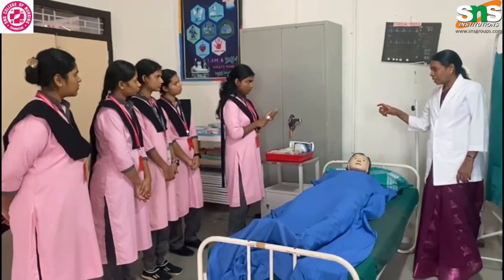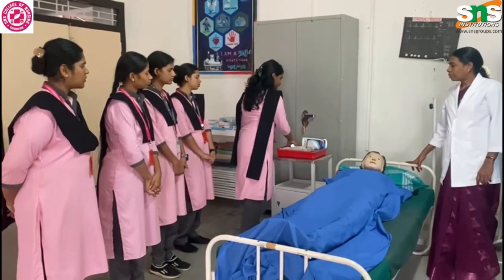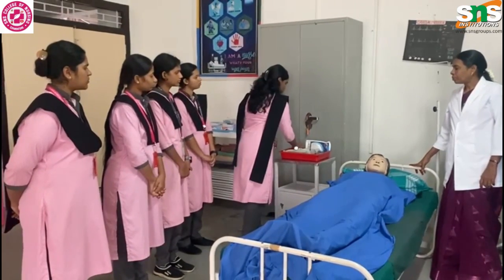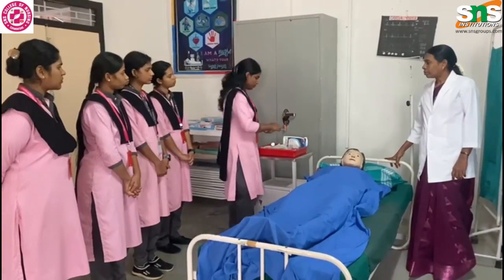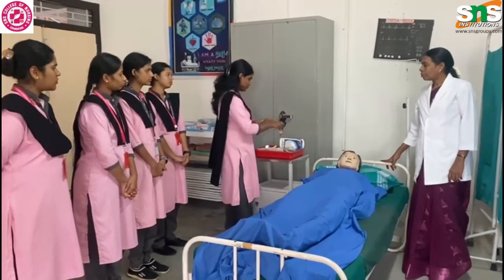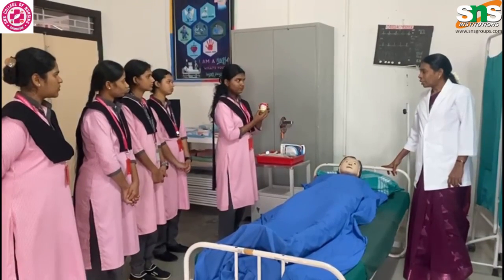You separate this one. We use this barrel to feed the patient, and we have a mortar and a vessel to crush the medications. And we have a stethoscope to assess the peristaltic movement and placement of the tube, and a measuring cup to measure the medications, and a plaster to secure the tube position.